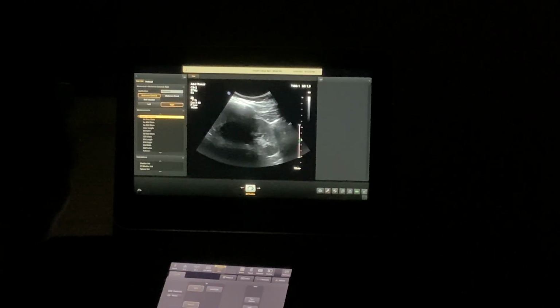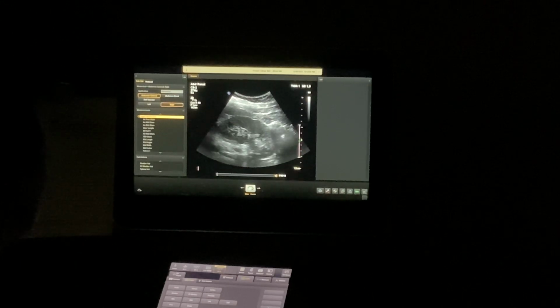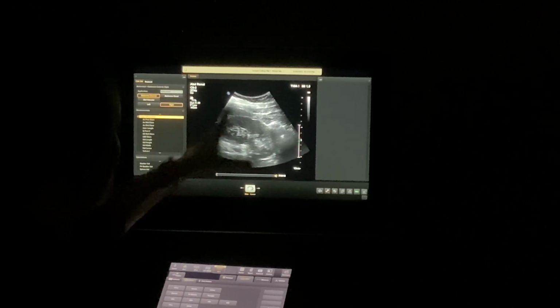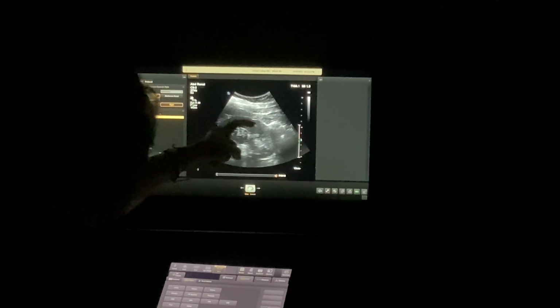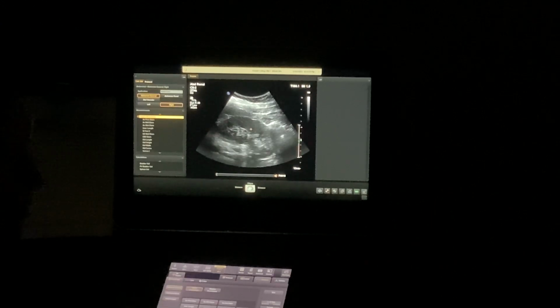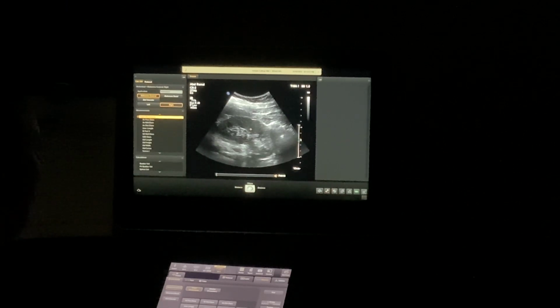So for her to get a measurement, I'll do the best I can here. Breathe. This is just an example. If this is all you can get on a patient for a length, I'm mid, even sinus, fairly even cortex, and I can see both of my poles for a measurement. It's not perpendicular. It's not as pretty as the right one, but if that is the best you can get, make it look as good as you possibly can. Tick all the boxes with what you're given. So I would do here to here for my length measurement.